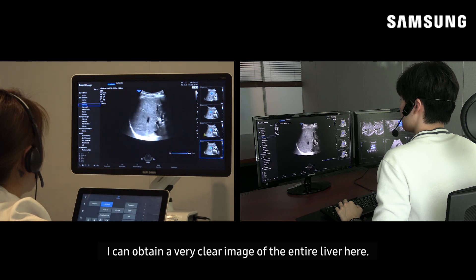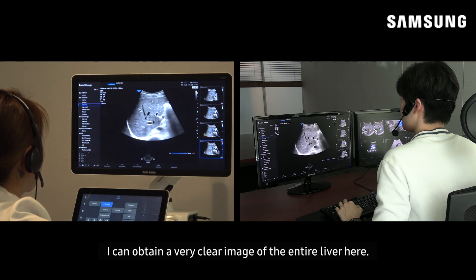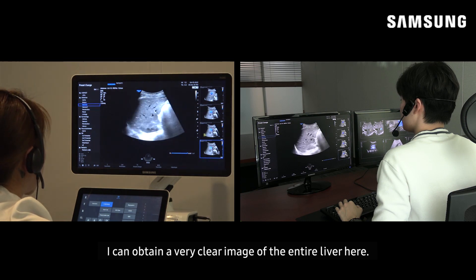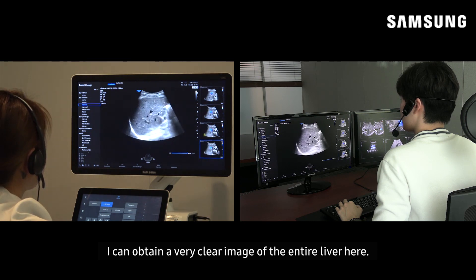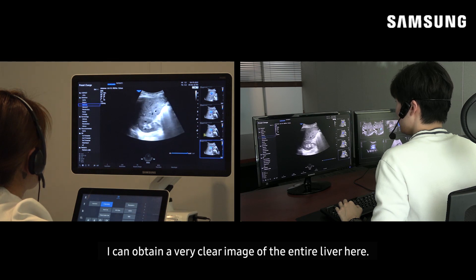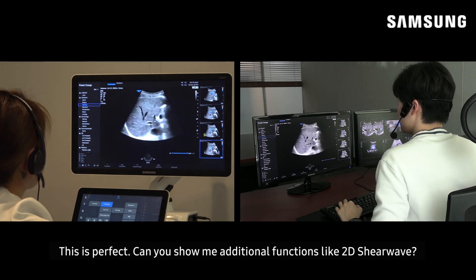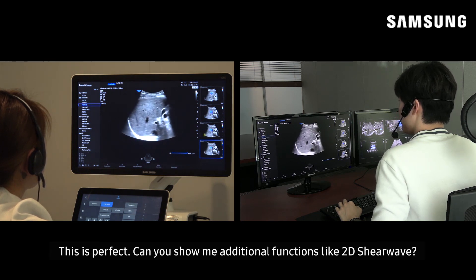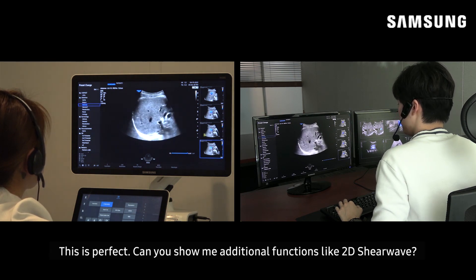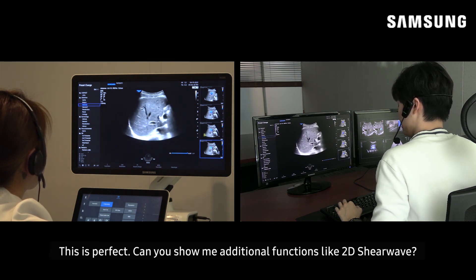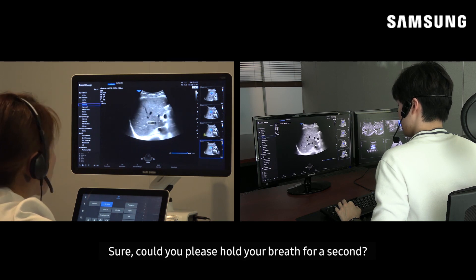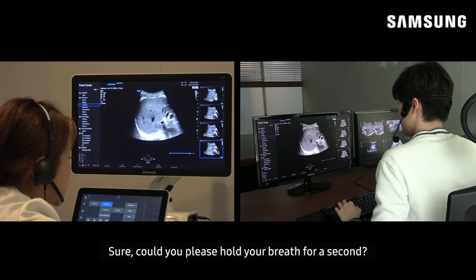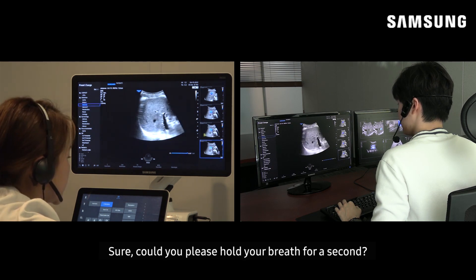I can obtain a very clear entire liver here. This is perfect. Can you show me additional functions like the 2D shear wave? Sure.